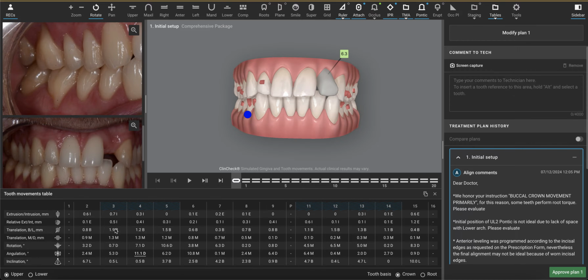What we're looking for is, don't move the tooth, or let me graft it first, or move it and then let me graft it, something to that effect. Good risk mitigation strategy to build the specialist into a case like this, for sure.